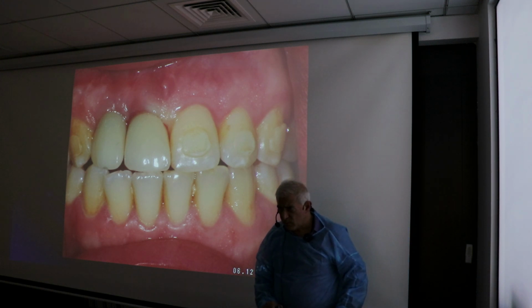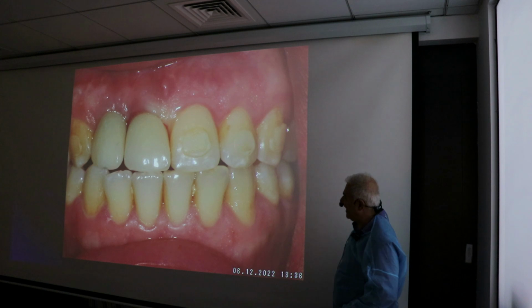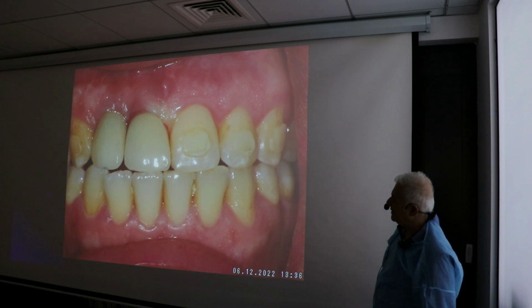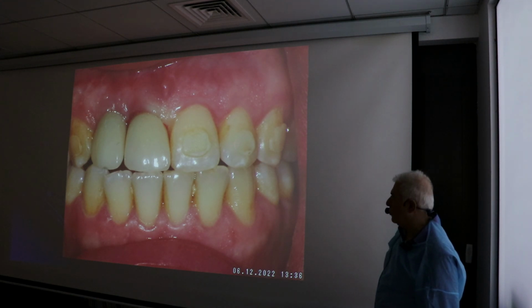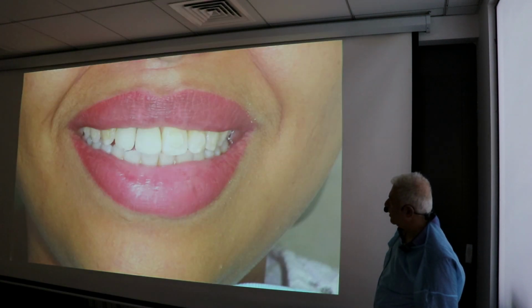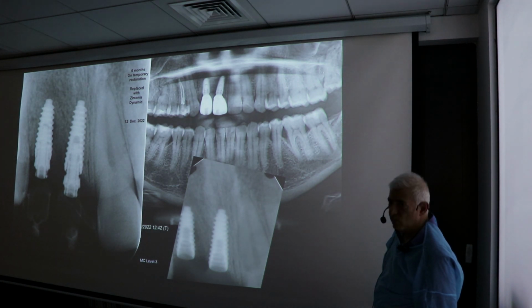Could you augment the interdental bone by tenting, vertical bone or soft tissue? No, bone. By tenting with a mini titanium screw. Tenting mini screw, yeah, vertical. Could be. No, you didn't do a soft tissue graft.